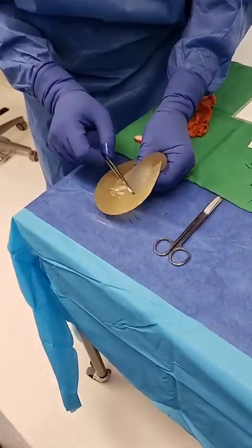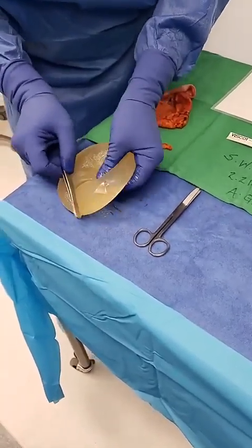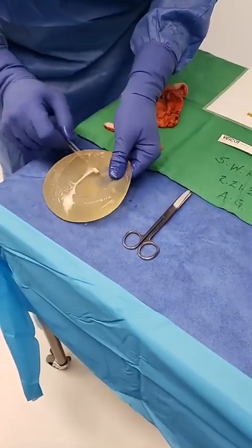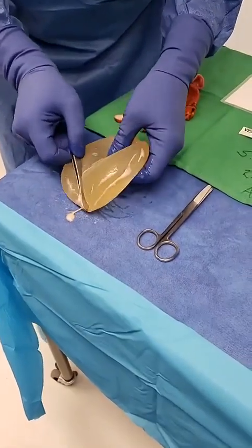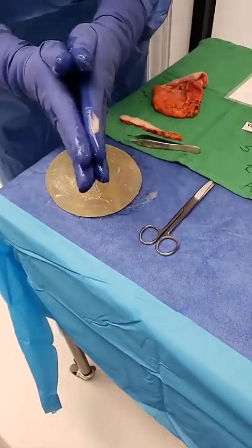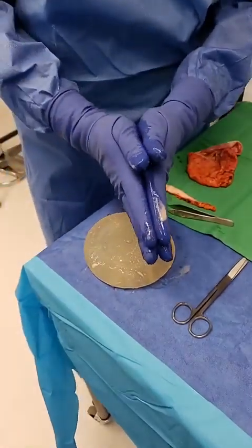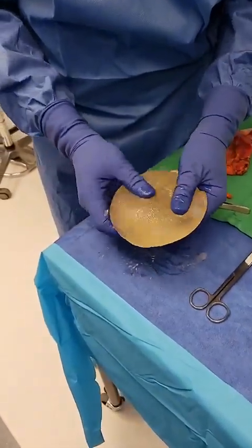Look at all this. This is textured implants. It's not soft. And look at all this fluid that's around. Very intact implant, very much intact. And you have this, if I show you, look at this gel bleed. This is slowly leaching into the periphery. This is what we have seen constantly with intact saline implants, intact silicone implants, as you will see.